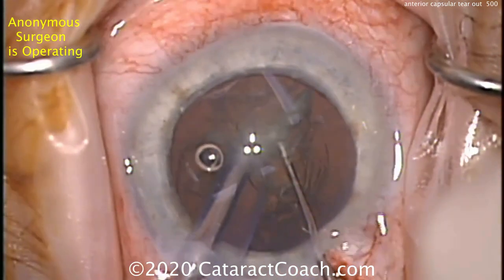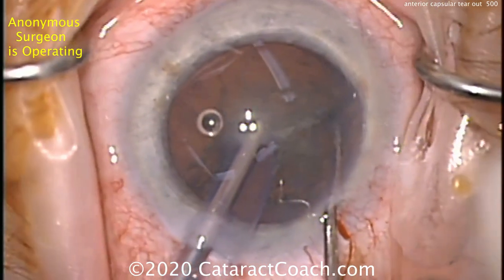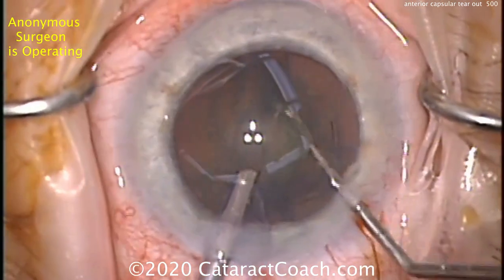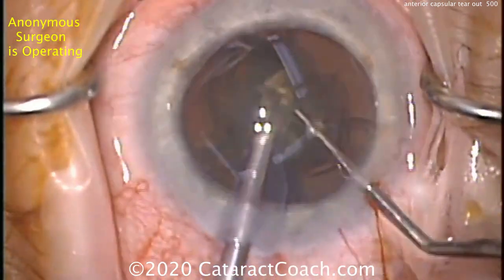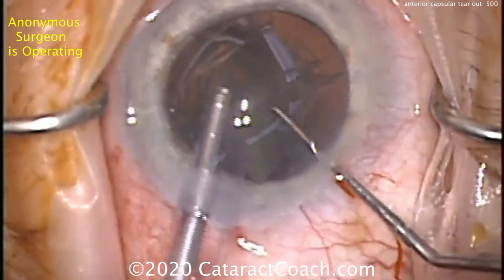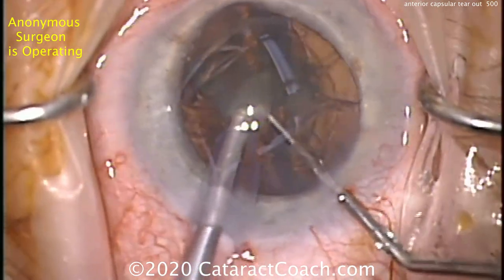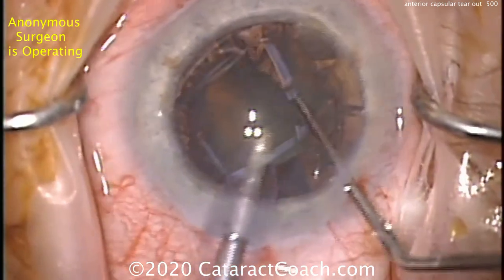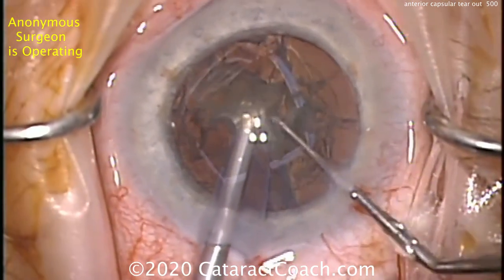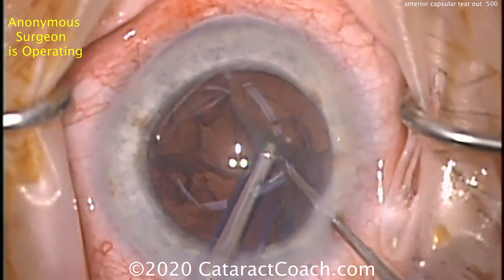Let's see what kind of nuclear technique we're going to do — looks like a chop, a little horizontal chop, that looks pretty reasonable. Got a partial chop there, buzzing again, using the chopper to bring it up out of the capsular bag. Pretty good, all looks routine. Certainly you can tell this is an advanced surgeon. By the way, the draping is pretty good — all lashes are out of the way, this looks like a beautiful case. A little more FACO power, judicious use, and you can see the nucleus comes out of the eye very quickly.